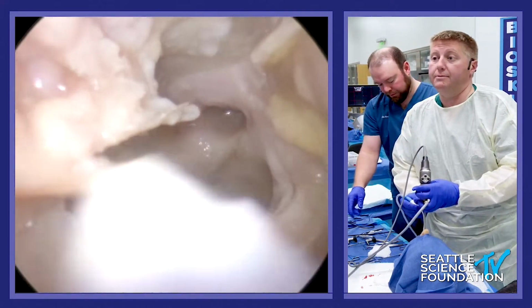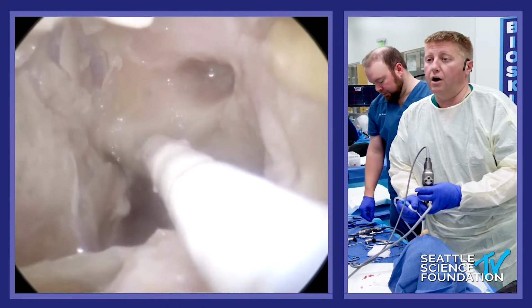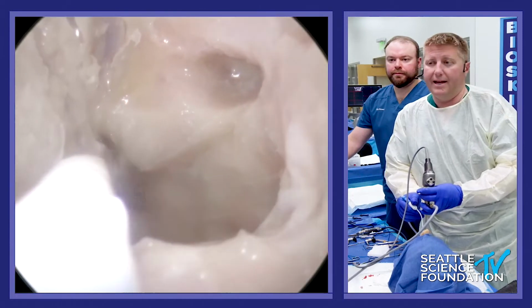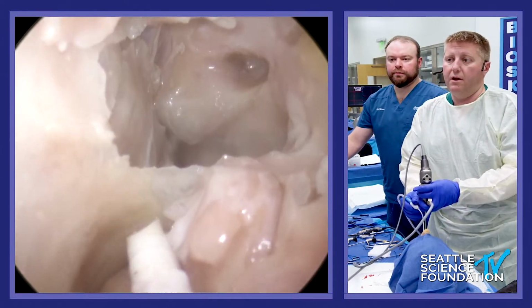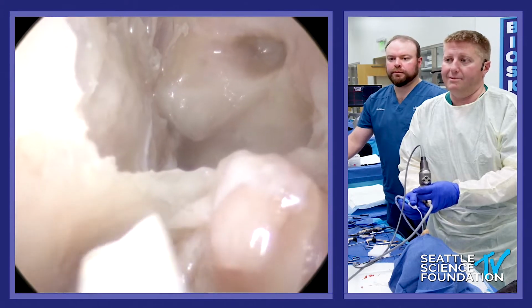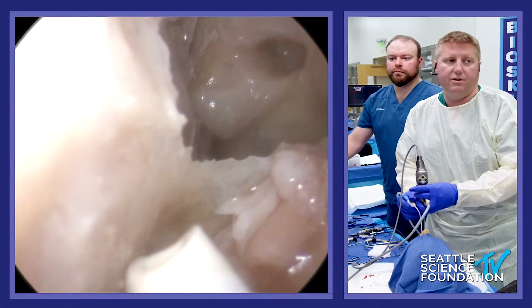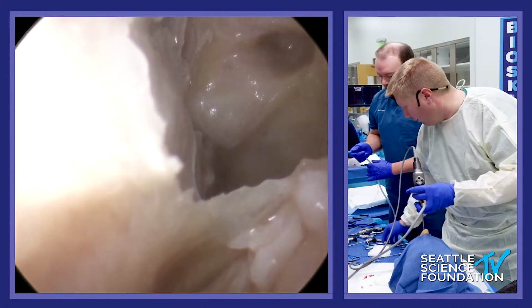Why a drill? What's that? I'm sorry. I'll usually use a diamond because it's actually the way we open up the sella, and I can still be pretty efficient with it. A cutter would be fine here, but honestly, I think to myself, well, if I don't have to open another drill bit, maybe I just won't do that. I don't know why I care. I'm saving the world, the healthcare world.